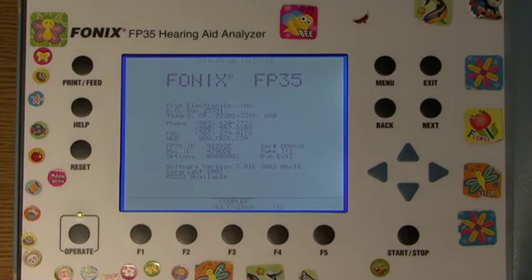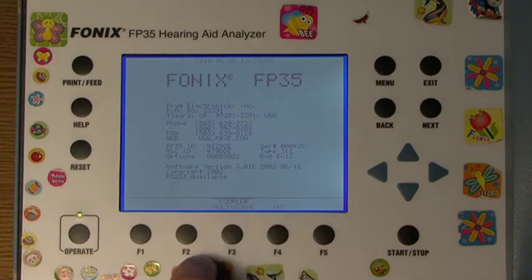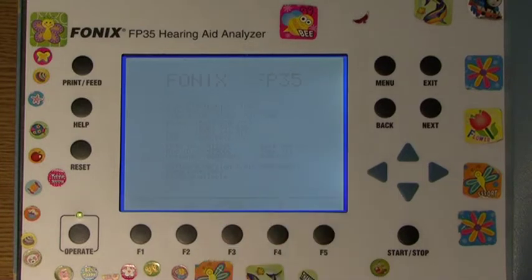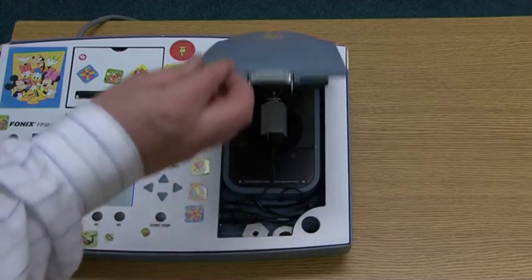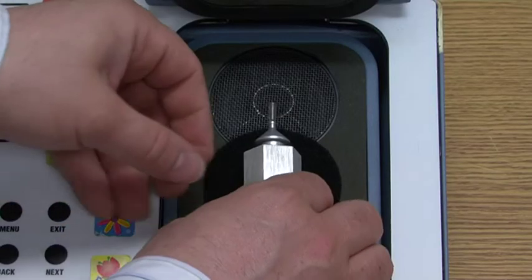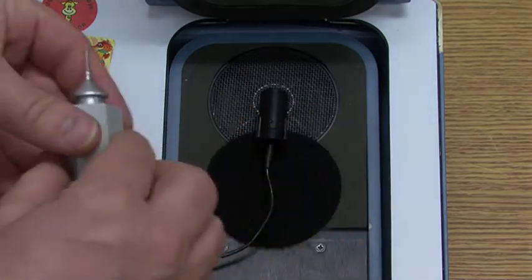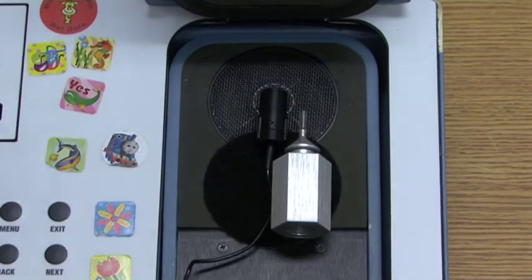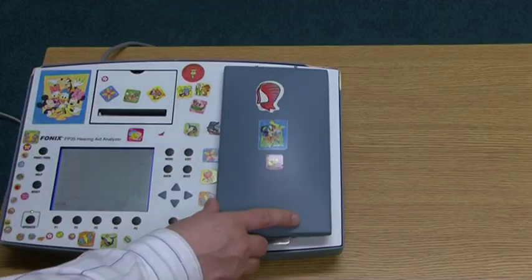You will see at the bottom of the screen, above the F3 button, the words Coupler Multicurve. Press the F3 button. Next, you will need to level the test chamber. Open the chamber lid and place the reference microphone into the center circle of the speaker, then place the HA2 coupler beside the microphone as shown. Close the lid.